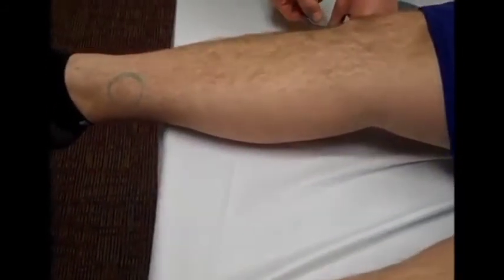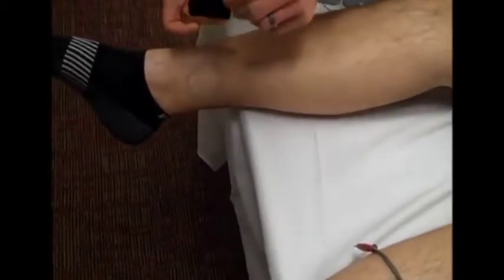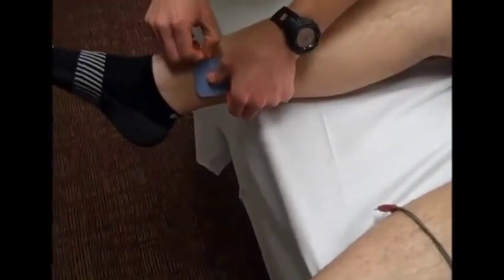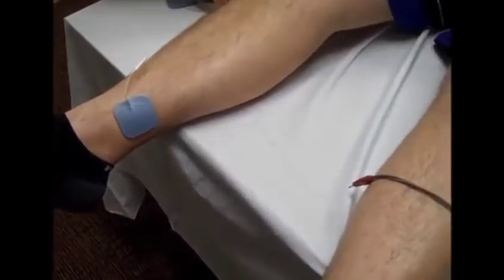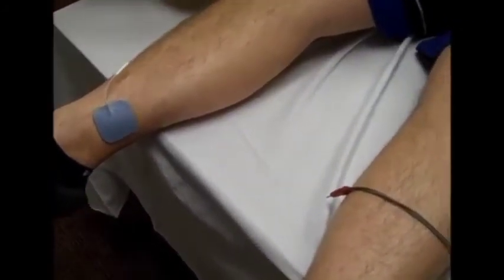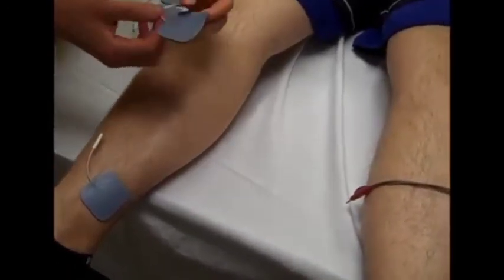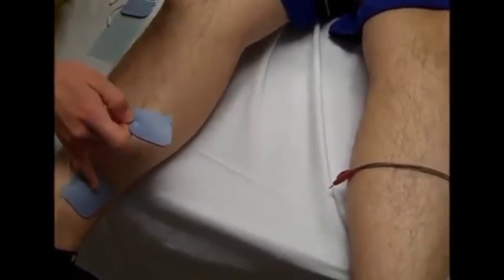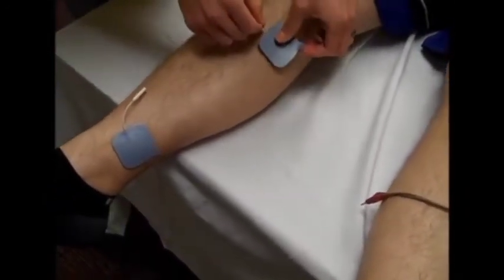we have a nice ulcer here on my patient's leg, drawn with a blue marker. So for the first placement is directly within the wound bed, and the second electrode placement is 15 to 20 centimeters away from the treatment electrode in healthy viable tissue.